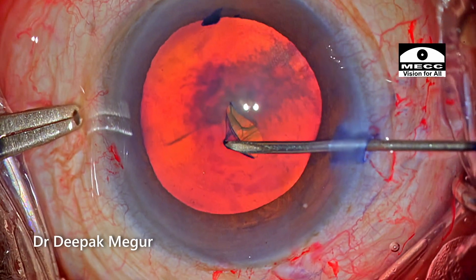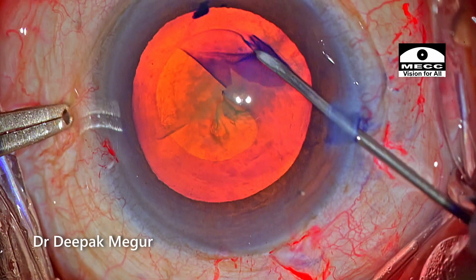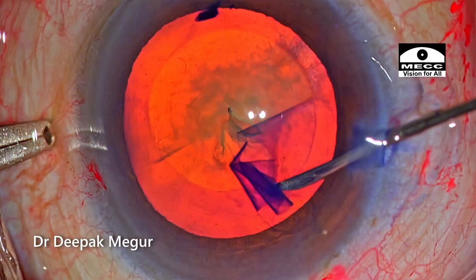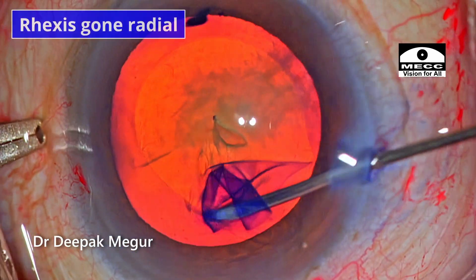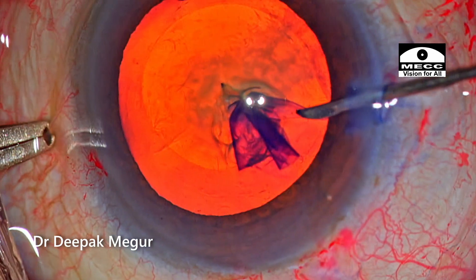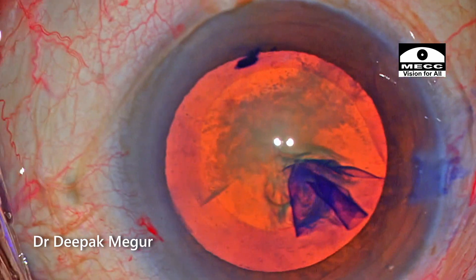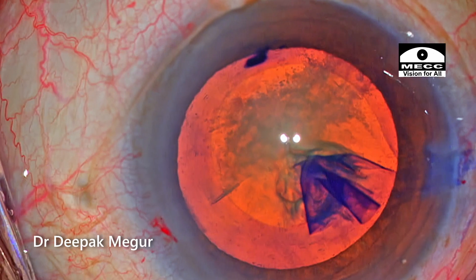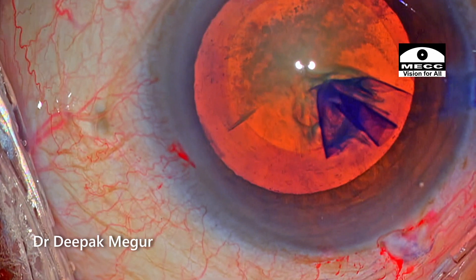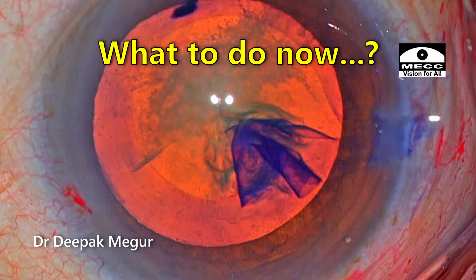This is a case which is planned for phacoemulsification and the rhexis is being done, and suddenly it just decides that it wants to go to the equator. I was using the needle and I needed to stop at this moment. It's important to realize that we need to stop at the right time, because if it is too late we can't retrieve it, and the needle is not the right tool to deal with such a situation.